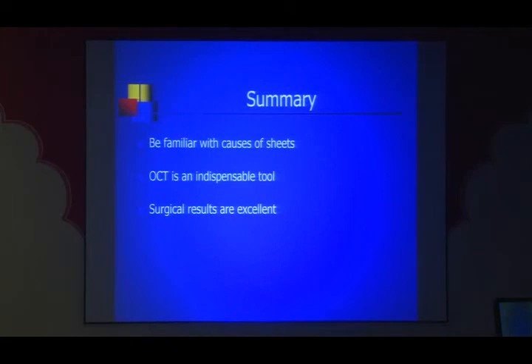So in summary, I would like to say that be familiar with the causes of sheets and striae. Clinically you have to examine, but OCT can always be used to confirm and quantify these lesions, and surgical results for these are excellent.